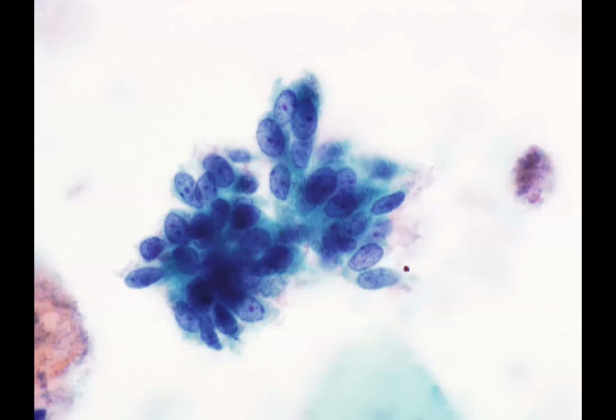This is an example, and this was called borderline changes in endocervical cells, and I can see absolutely why. You could even, if there were other groups looking similar, push it even higher to could this be query endocervical dyskaryosis. So what is it that's bothering me here?